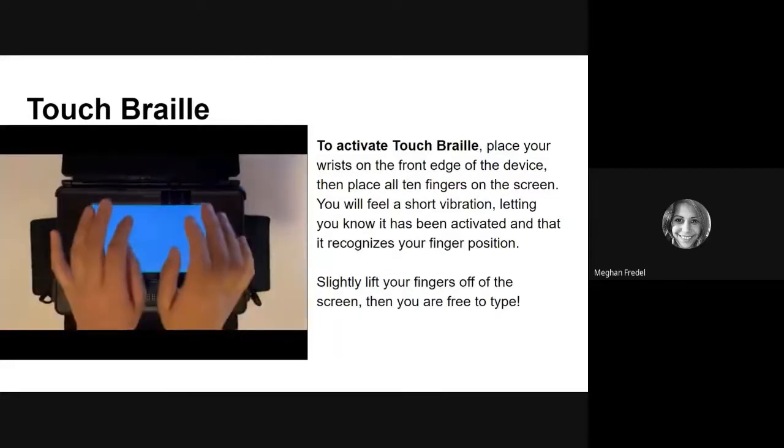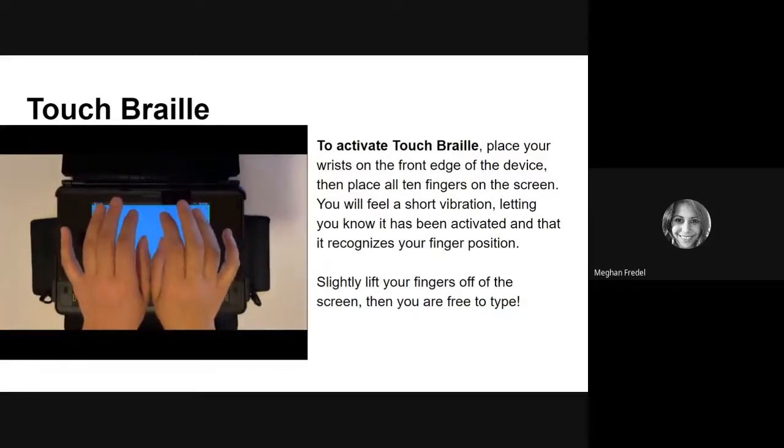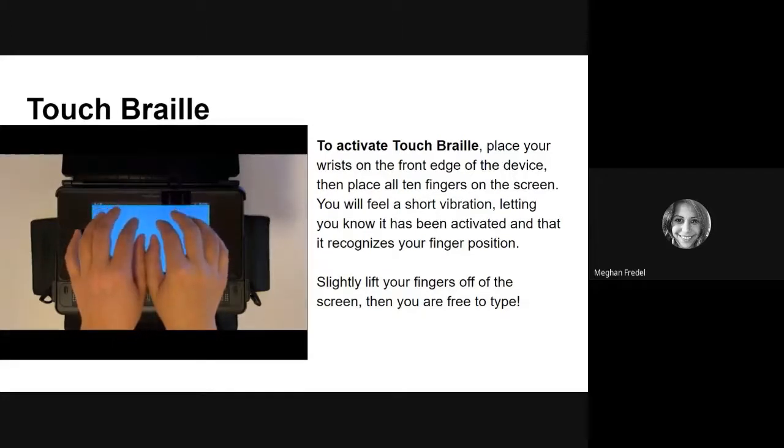Basically, gently put your wrist on the front edge of the device, and set all 10 fingers on the screen. Then you are going to feel a short vibration, and that's going to let you know Touch Braille has been activated, and then you just slightly lift your fingers off the screen and you're free to type. I felt the short vibration. All right, so I'm going to write Hi. Hi.